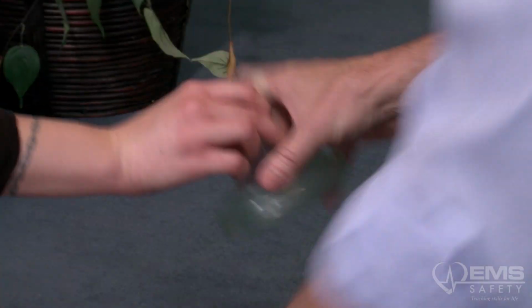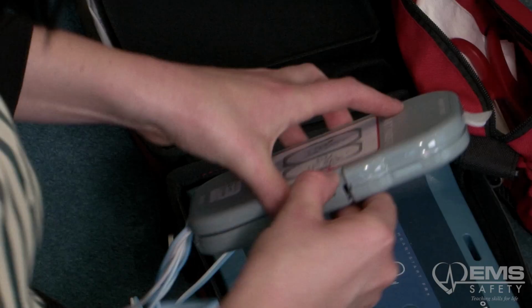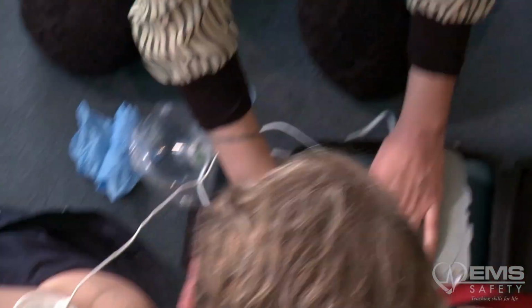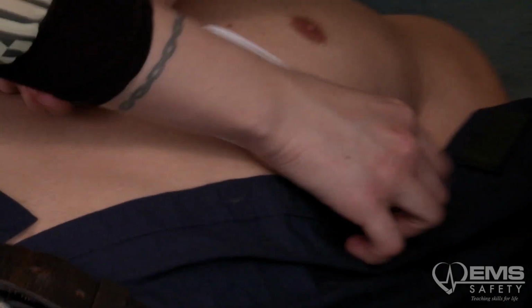Here's the mask. Peel white pads from gray plastic case. Attach pads to bare skin exactly as shown. Stay clear. Stop CPR.